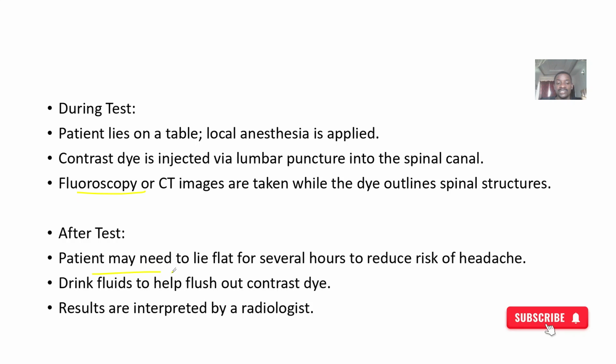So after the test, the patient may need to lie flat for several hours just to reduce the risk of headache, because you have tampered with the cerebrospinal fluid. They should also drink a lot of fluid to wash out the contrast dye. Okay, so that's what we got.